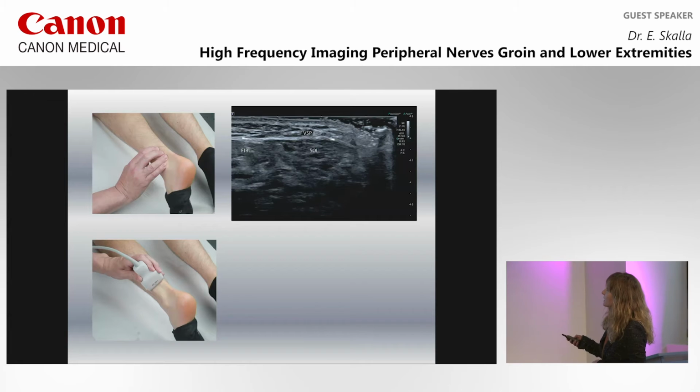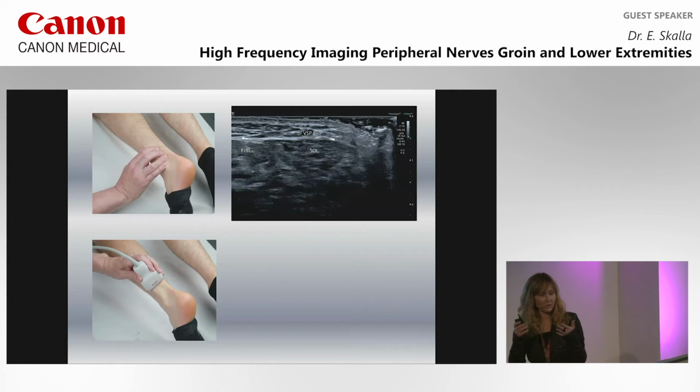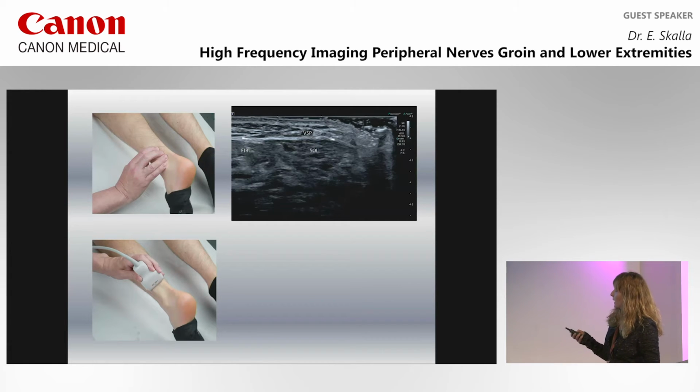Here, the fibular muscles, soleus muscle, distal end, the other side, and we have seen on the medial side. And the important region now is the subcutis. And here we see this small dark spot, the small saphenous vein. And this is our internal landmark. So you have to be very careful, no pressure at all, because when you press the probe a little bit on the skin, you won't see the vein anymore.